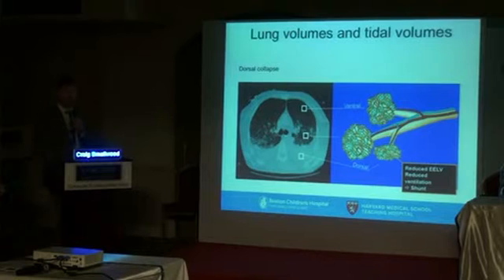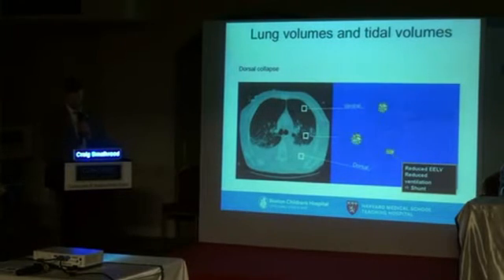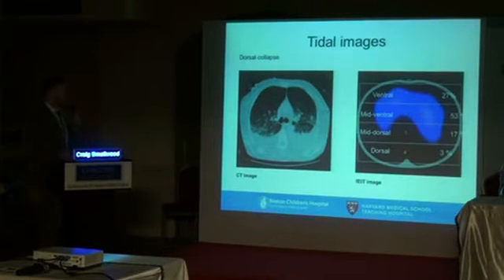And the lung has a tremendous ability to compensate for areas where there is no ventilation. It just tries to constrict those vessels as much as possible to reduce blood flow and reduce the impact of a VQ mismatch. However, it can only do that to a certain degree. So it's never going to collapse those vessels completely, so you're always going to have some degree of shunting. And this is what that image looks like.